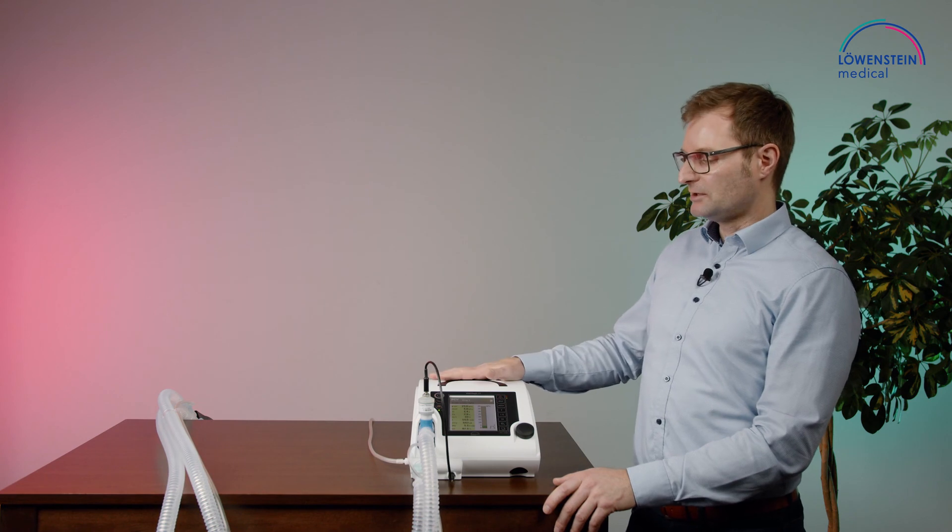The oxygen sensor calibration needs to be done every time the device is put on a patient — on a new patient, or every 24 hours.